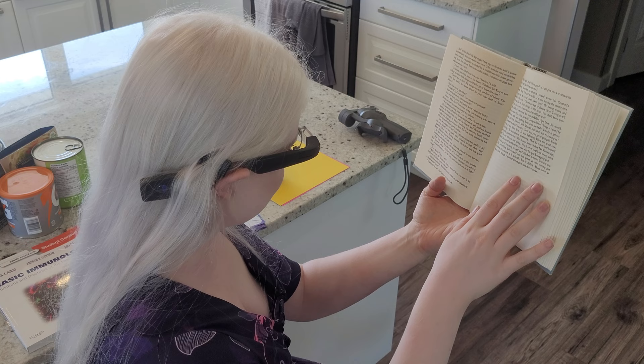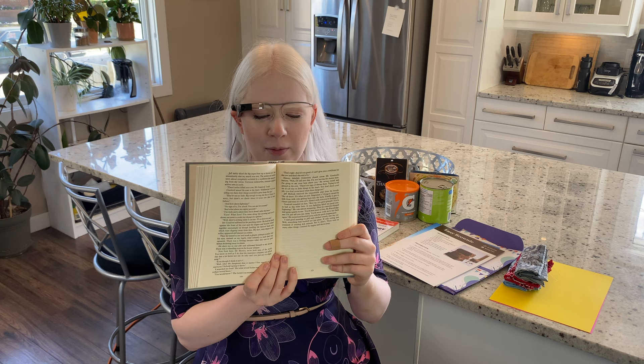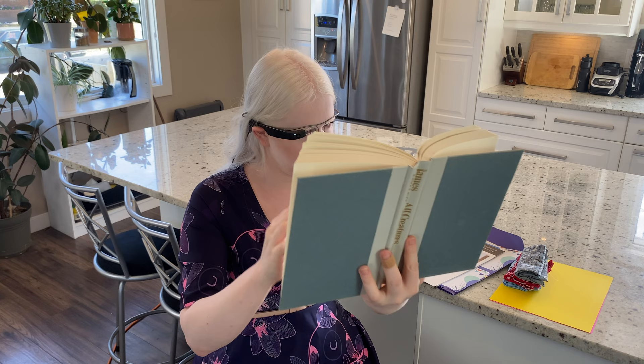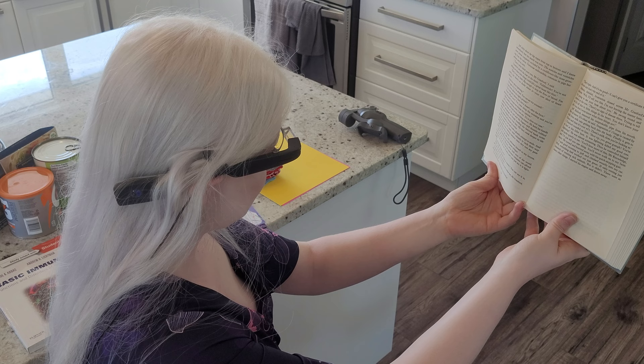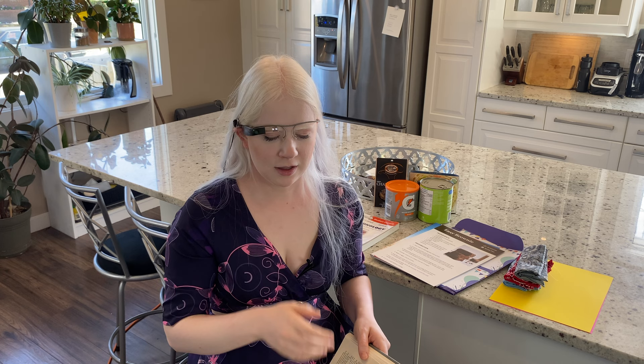Occasionally it gets fragments: 'deftly sliced the big organ from top to bed... immediately that my search was over... completely occluded by a cauliflower... verrucous endocarditis, seldom seen in cattle.' The text is right way up and it's reading some of the words but not all of the words. I try moving it further back, starting really far back. It's still half gibberish unfortunately.